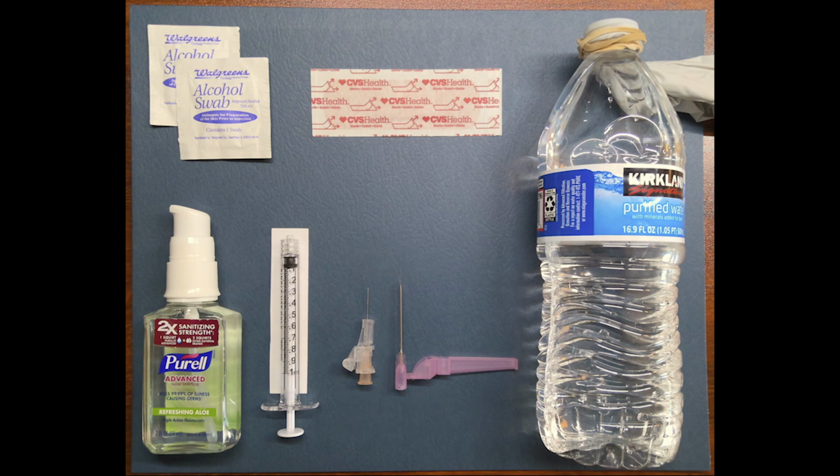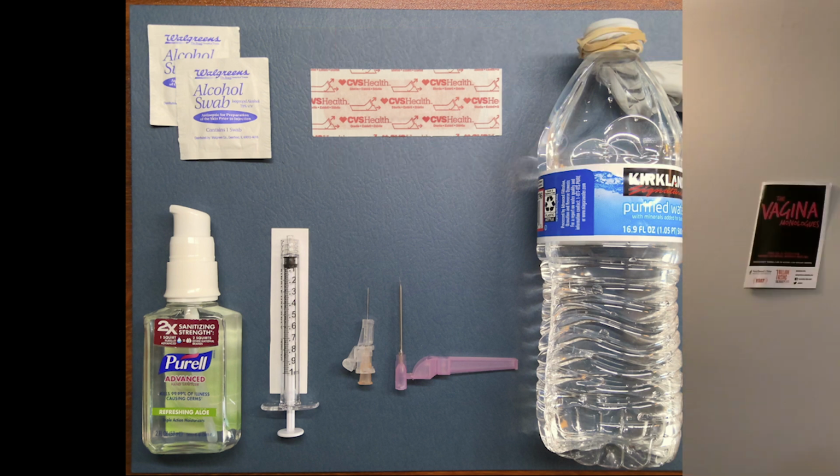Injection needles can have a gauge ranging from 21 to 25 and a length ranging from 1/2 inch to a whole inch. A Band-Aid, and a sharps container. If you do not have a medical grade sharps box, a sturdy plastic laundry detergent container makes a great substitute.